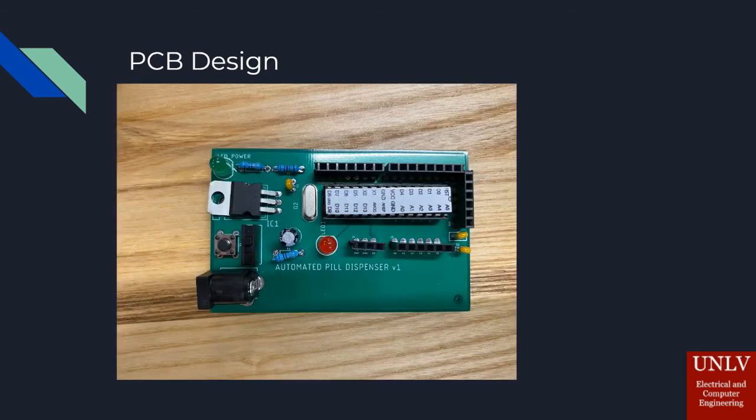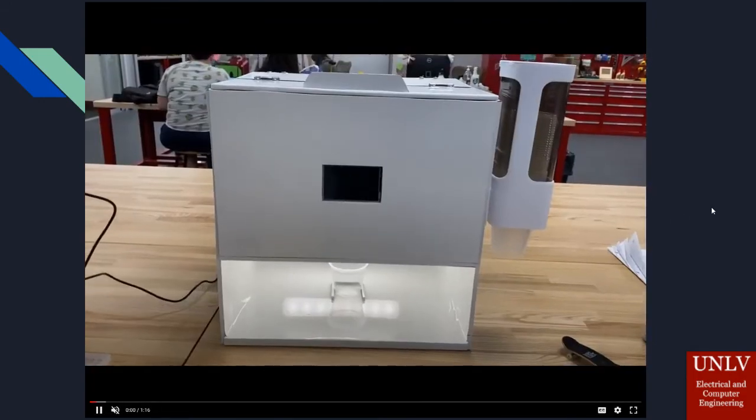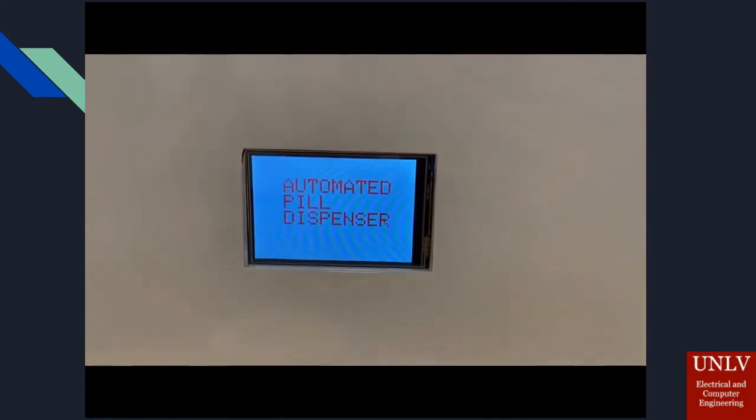And here's our PCB design that is based on the Arduino Uno that we use to control our motors. And here's a video of our entire project. So here we turn it on. Display shows the name of our project, Automated Pill Dispenser.